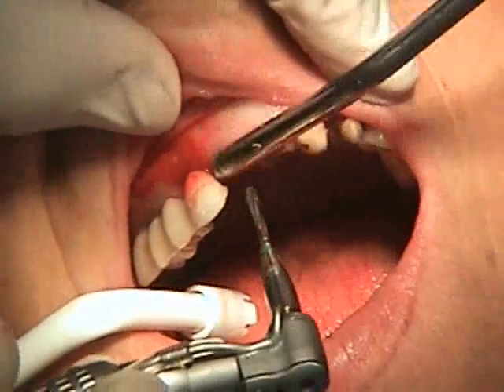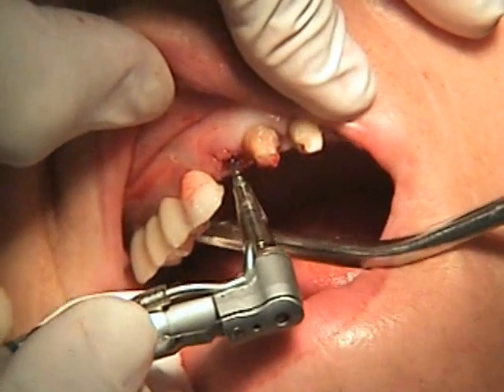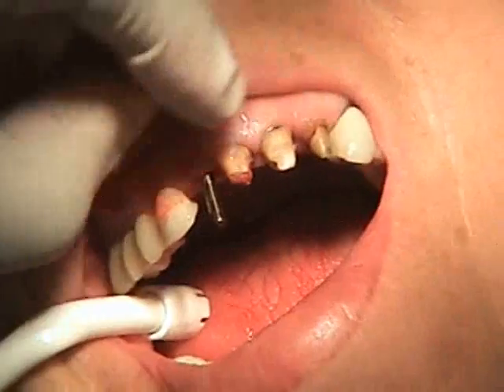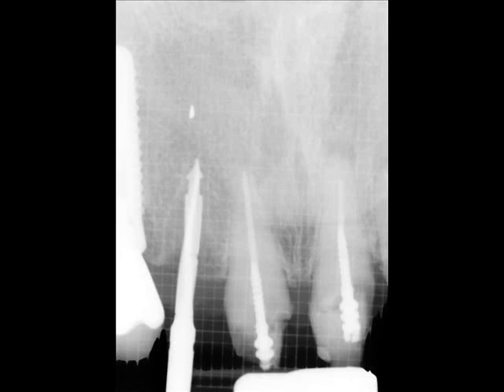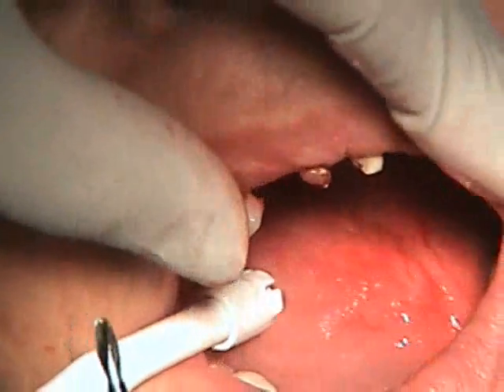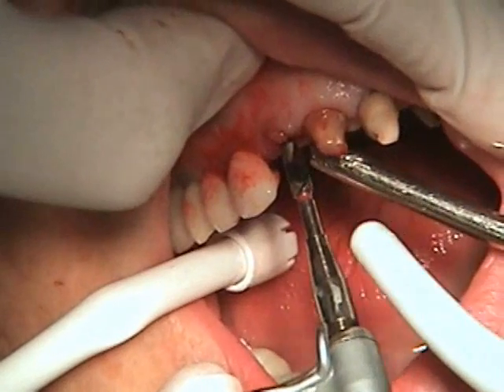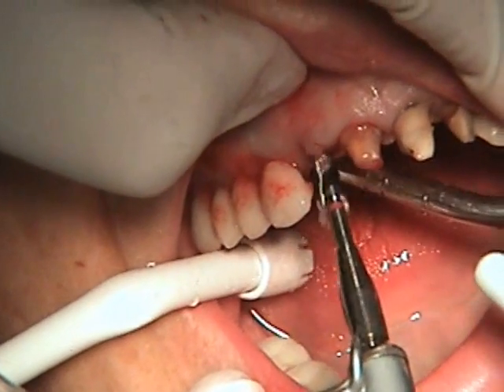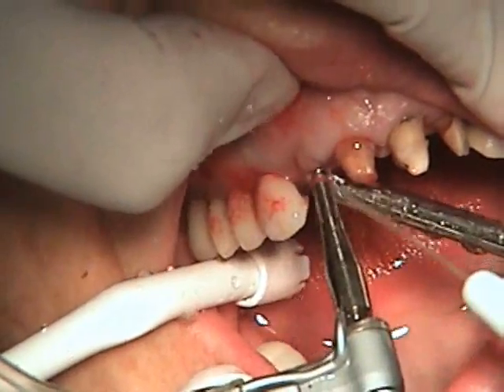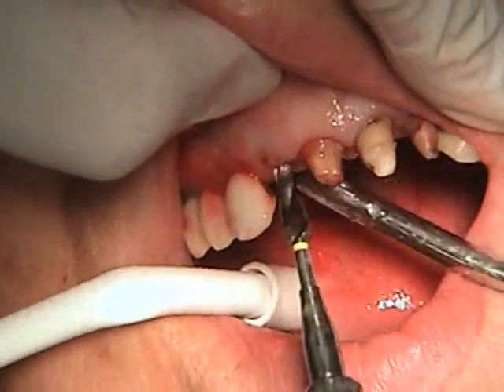The root socket was intact, so now we're going to go ahead and use a pilot burr. With some copious irrigation — the bone seems pretty soft. We'll take an x-ray to make sure we're in the right direction. You can see a little bit of metal from a previous apicoectomy that's inside. We're going to use the Blue Sky Bio 3.5 drill initially. We have some suspicion that the bone is a bit soft, and that's being confirmed — the bone seems quite soft.